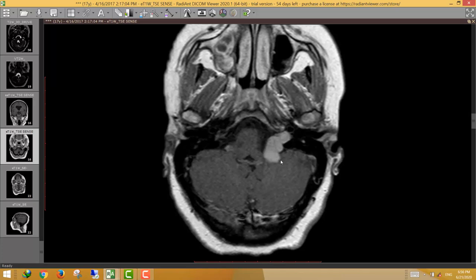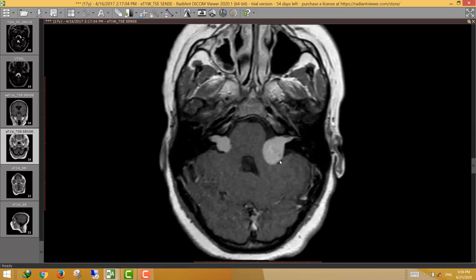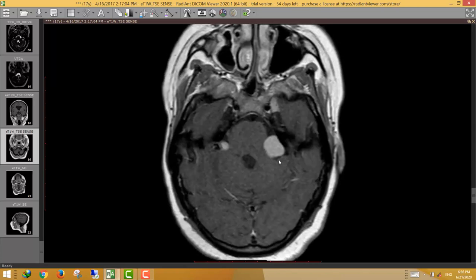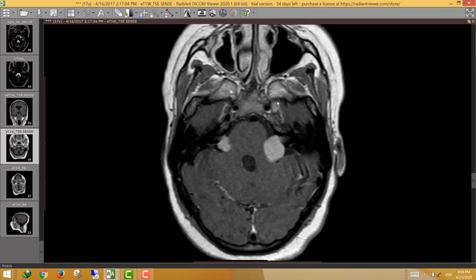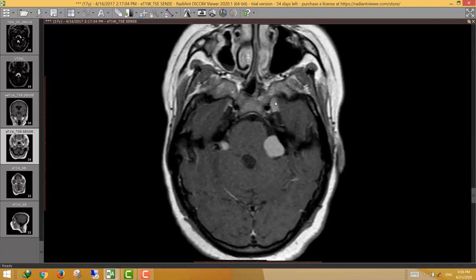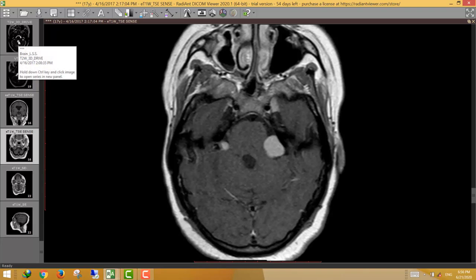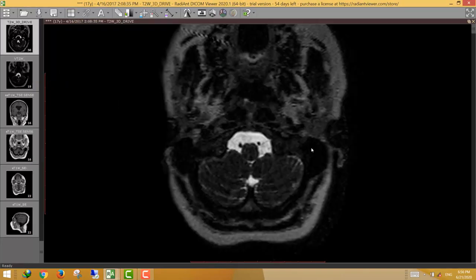Another important site for schwannoma is the parasellar region, which is the site of the trigeminal ganglion. We can see a small enhancing lesion at the left parasellar region in the region of Meckel's cave, the site of the trigeminal ganglia and branches of the trigeminal nerve. This is another cranial nerve schwannoma.